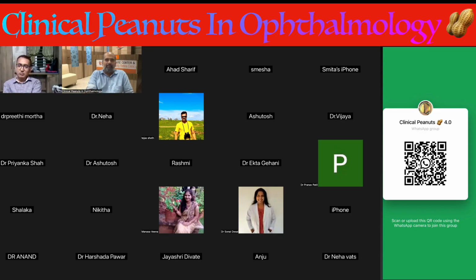Okay, another question: is there something like a good astigmatism? Do you leave it? Yes, something like good astigmatism is a conceptual point. If you are leaving some astigmatism in the vertical plane, that is with-the-rule astigmatism, they are having better contrast if you are leaving some residual with-the-rule astigmatism.